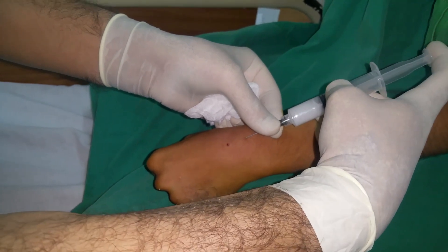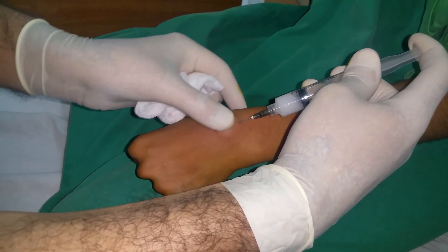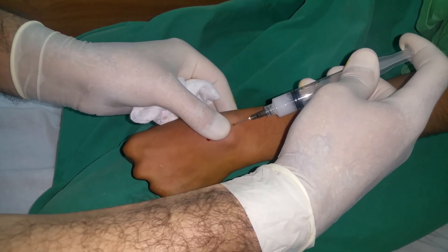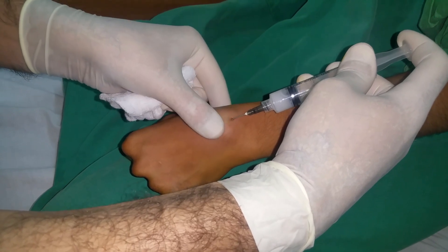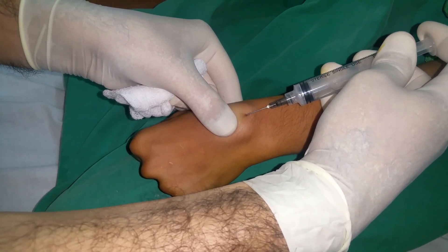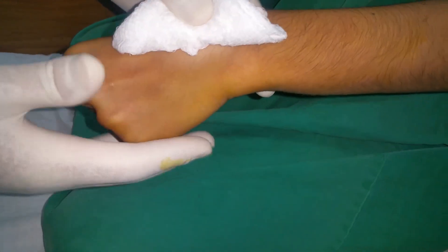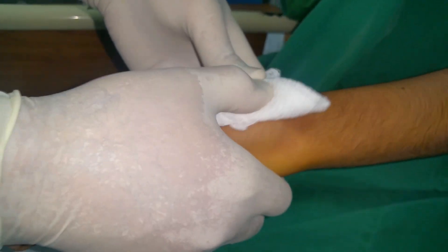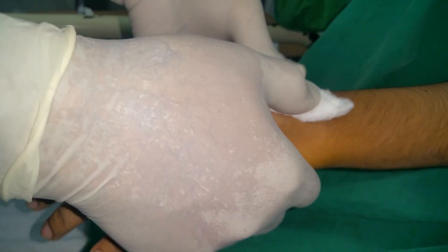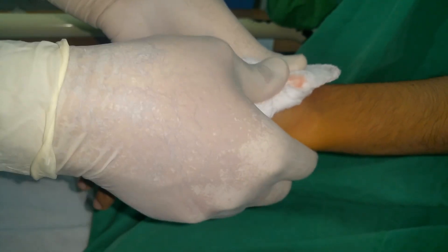We will now inject the steroid into it. The cavity has filled up again because we have injected the steroid into it. It will now spread all over this cyst and also track down into the area where it communicates with the joint and the tendon sheath.